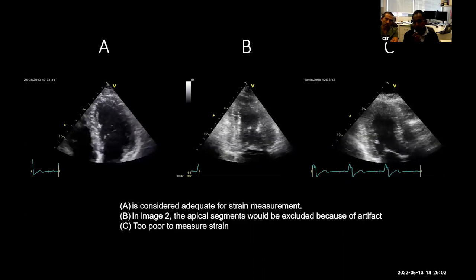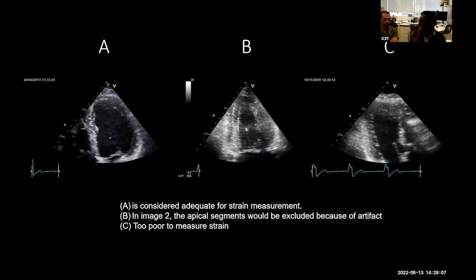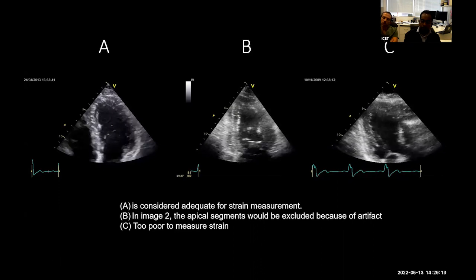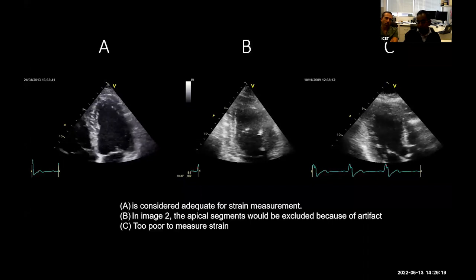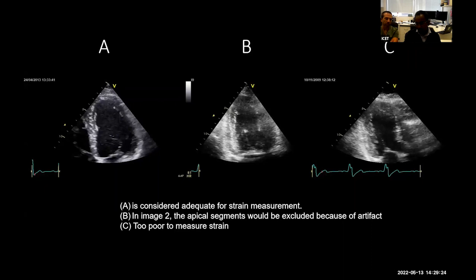Yeah, when you get contrast, it becomes tricky. It actually becomes harder sometimes to track the strain. The software really struggles. Okay. But I guess in this case, you're sometimes doing retrospective, not retrospective analysis of this, so then it's all post-processing. Yeah, post-processing.